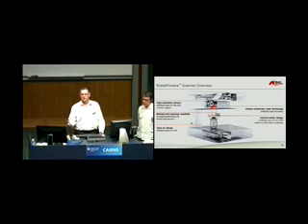People often ask me, how long does it take to scan? My answer is it depends what you're trying to scan. If it's just a basic single unit, we can actually scan 12 single units at a time.